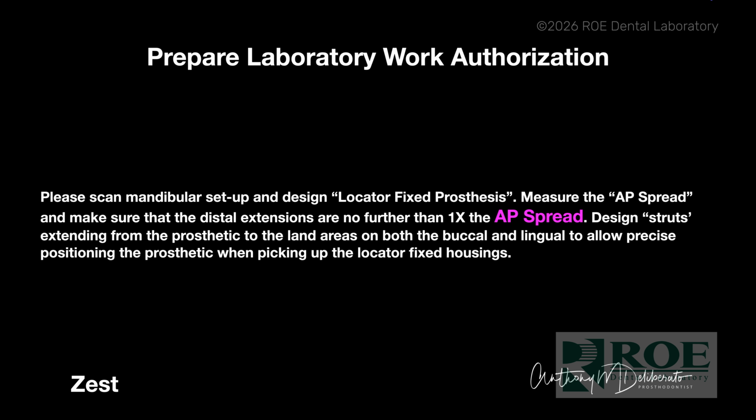So you'll see what these struts are, but this is going to allow us to do the pickup of the prosthesis in the exact same position as the setup. And that'll become clearer as you see the following slides.